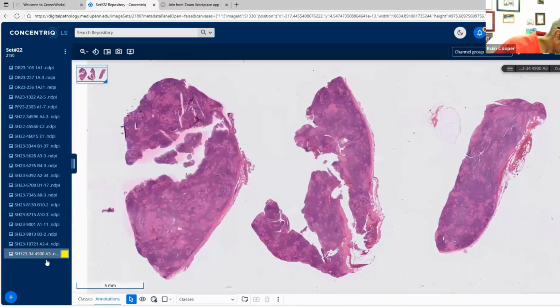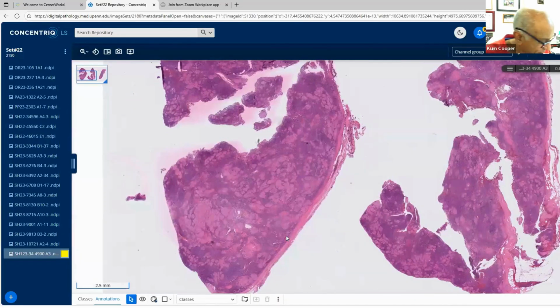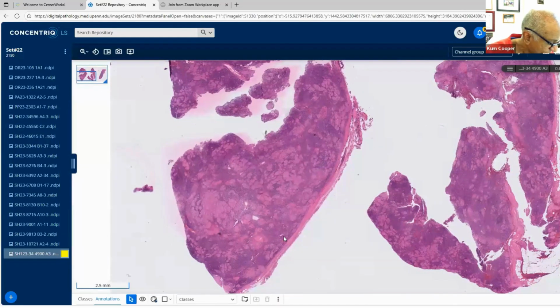All right. This is a case I got from my good old friend who's a hematopathologist, Dr. Adam Bagg. And he received this as a consult, so it was from the outside. And these are neck lymph nodes, lymphadenopathy, head and neck. This is a 36-year-old man.